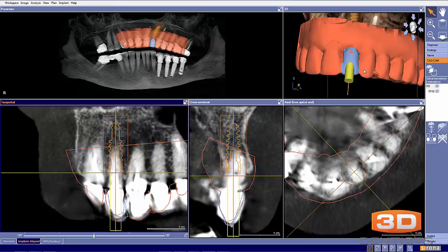I would consider an immediate provisional load to maintain the soft tissue. The provisional, I would mill chairside, have a screw hole access on the buccal, patch with composite. I would also go ahead and take an impression with a Nobel ELO scan, intraoral scan body, send that to the lab for a final screw retained angulated screw channel to be fabricated as well.